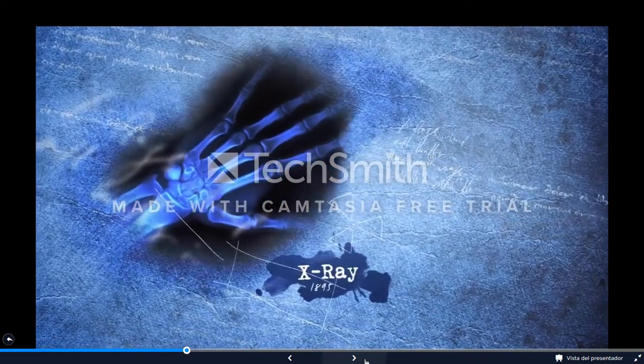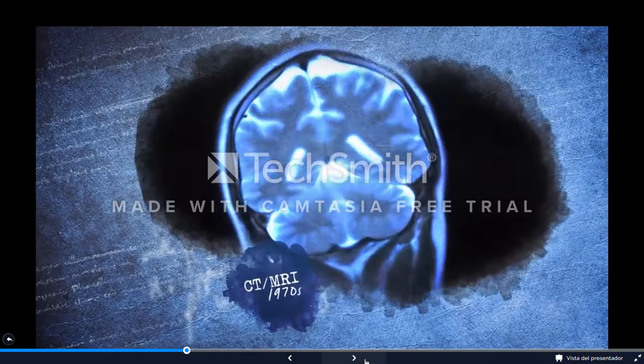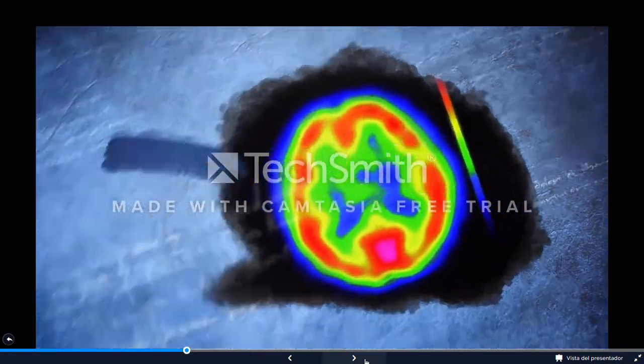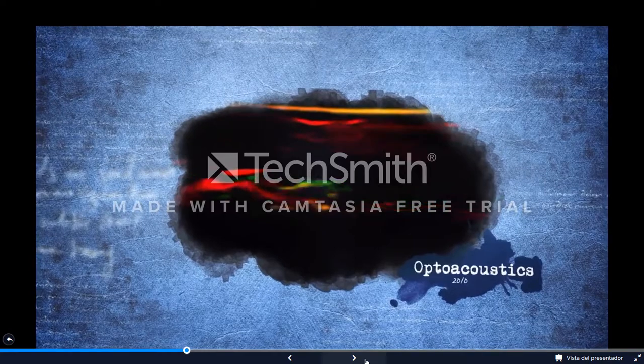Imaging is an essential tool for medical diagnosis. Various technologies have evolved over time, each one providing specific benefits, but also limitations. The newest biomedical imaging technology is optoacoustic tomography. It is based on the photoacoustic effect.